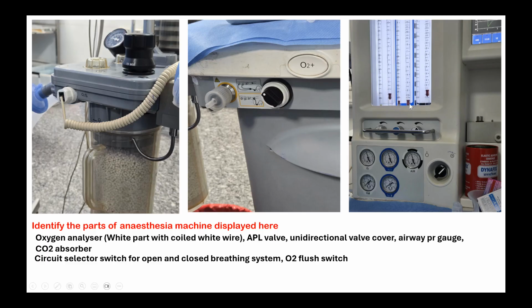Okay, the first tube is empty. So the float is now on the second tube. Probably the first tube float would have gone up to the maximum level. So it is the high flow that is being seen in the tube.